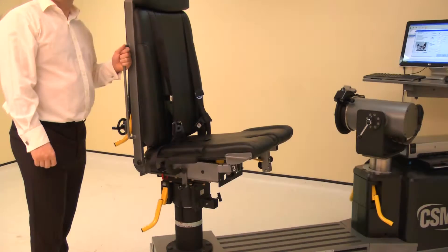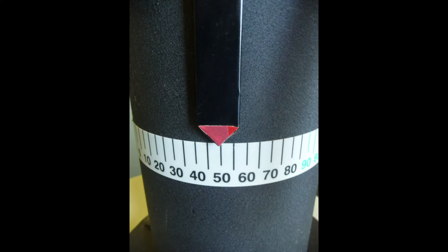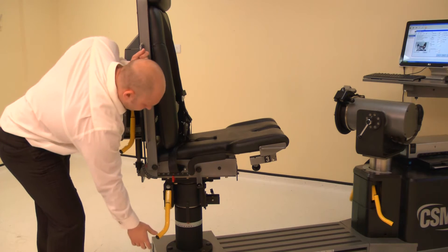Now adjust the chair rotation. Lift a locking handle and rotate the chair. For the right side, rotate the chair to 50 degrees on the black scale. Ensure both locking handles are pushed down to secure.